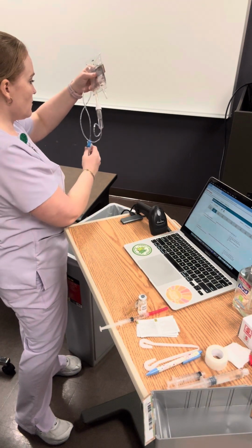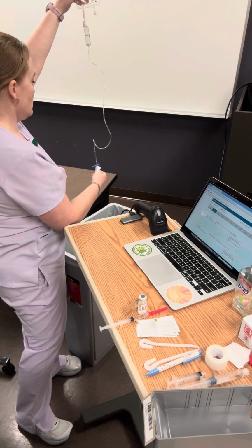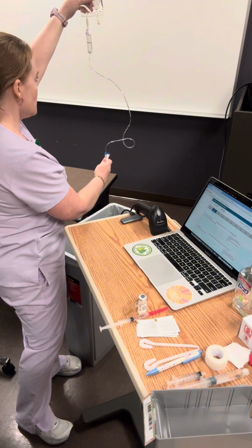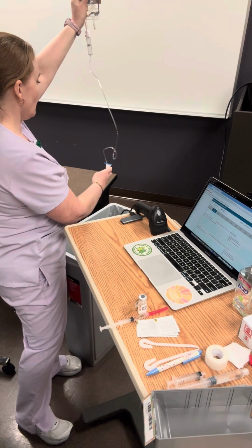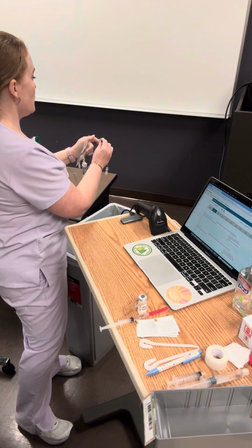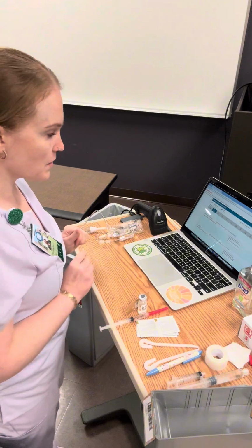Upside down, ensure that is halfway, making sure that I am not going to spill this when I am priming my line. Opening this up nice and slow, ensuring that there's no bubbles getting through. Okay. And I'm going to clamp that off both spots here. Okay, my medications are prepped and ready to go.